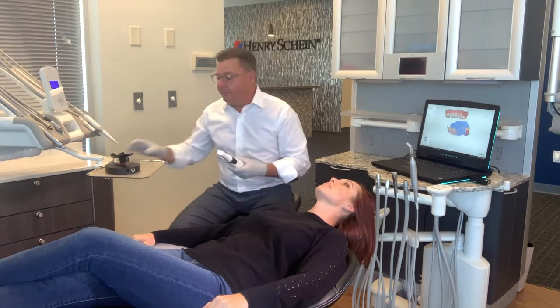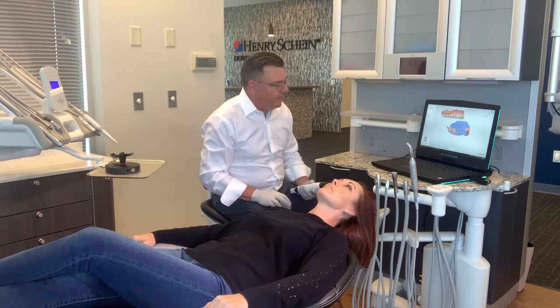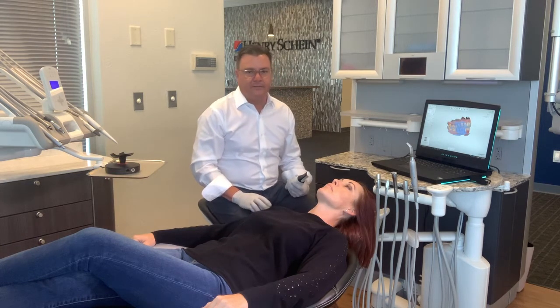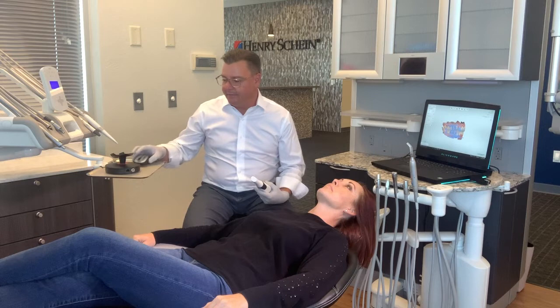Sometimes this happens with the software — I can't always tell you why — but right now it didn't automatically pin the bite. So all I have to do is move it into position so it's looking the same direction as my bite scan. Two clicks, and just like that, I fixed the bite. I don't have to spend time or re-scan. I knew I had enough information, so I just went back in and did it manually.